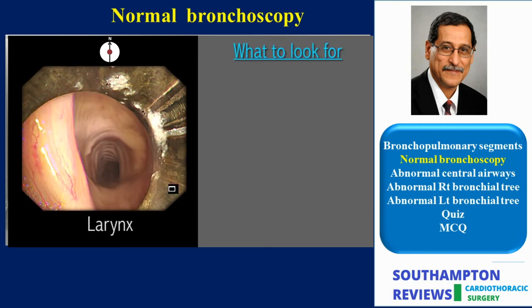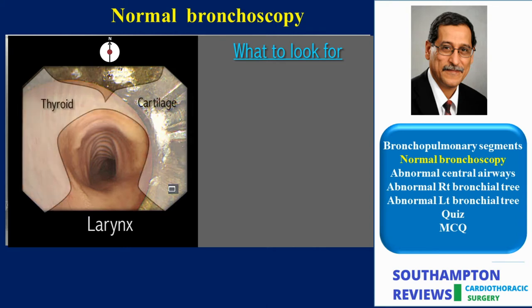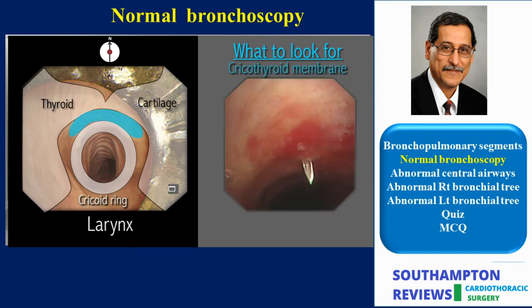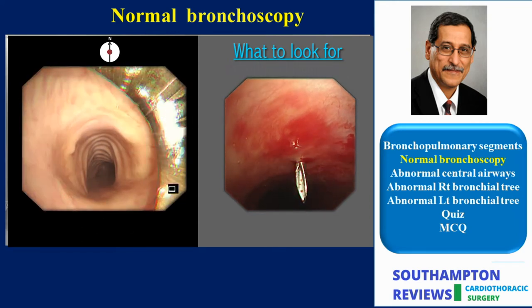This airbox is kept open at all times by a number of cartilages and membranes. We will only see the mucosal covering of these structures from the inside, but landmarks of the thyroid and the cricoid cartilages are noted. The first cartilaginous ring of the trachea is the cricoid cartilage, and it is the only complete ring. The cricothyroid membrane is the landmark for introducing a minitrach or injecting local anaesthetic.